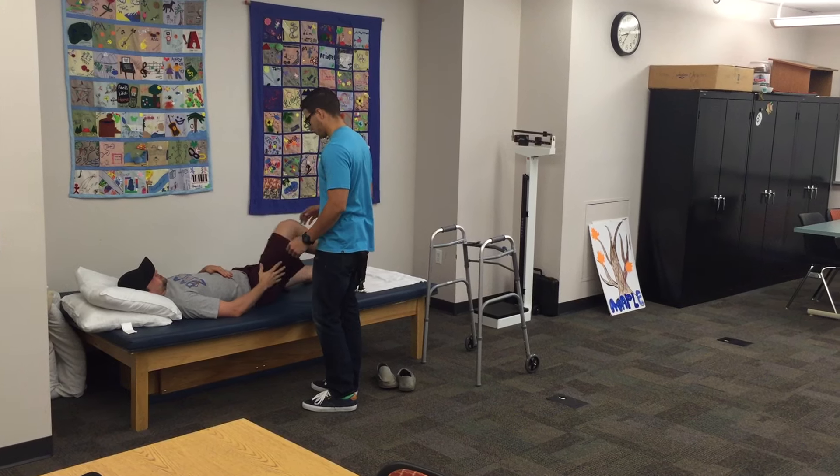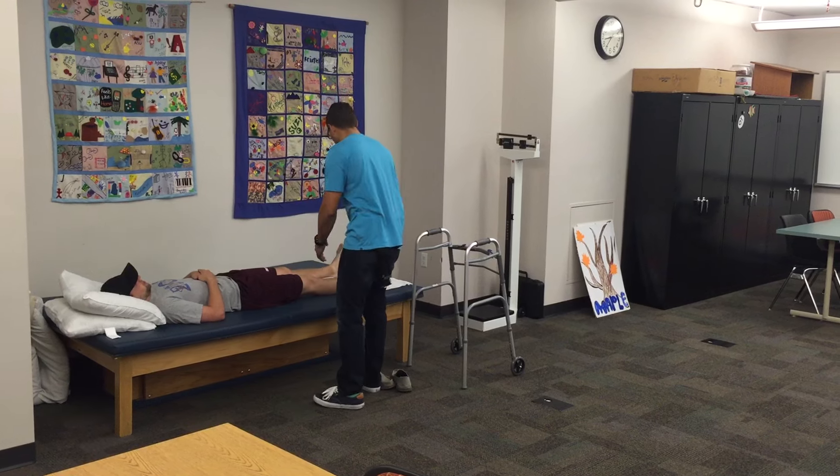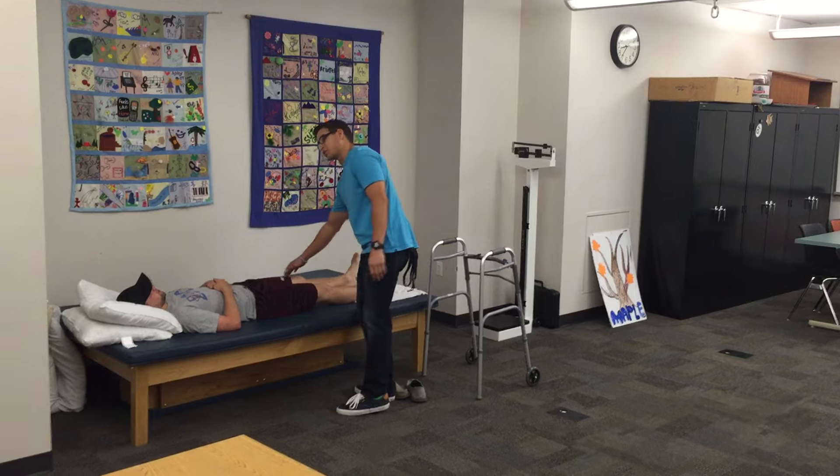So coming up like this. Perfect. And then don't cross the midline. The third one is going to be turning your toe in like this here. Okay. It's okay with the right — I don't want to see you doing that with the left.